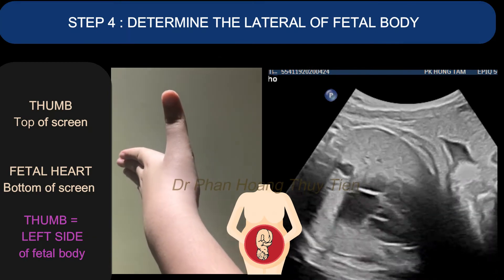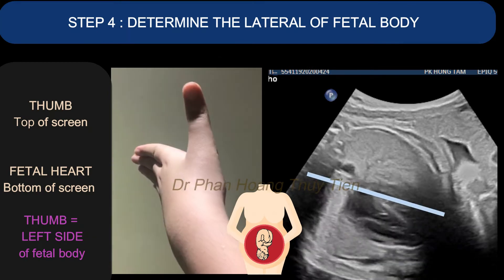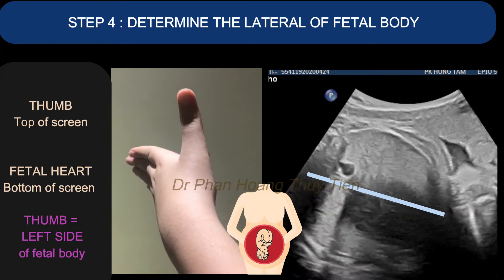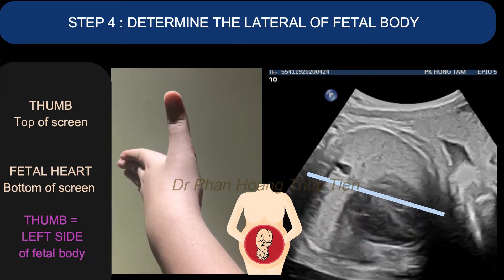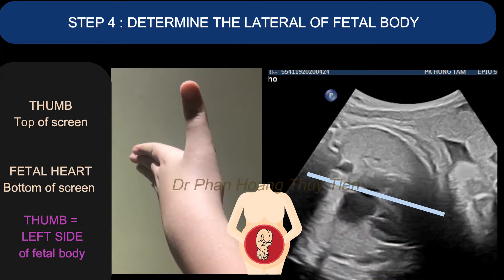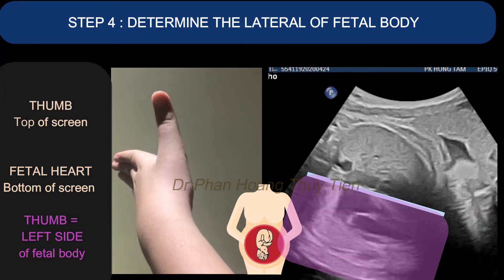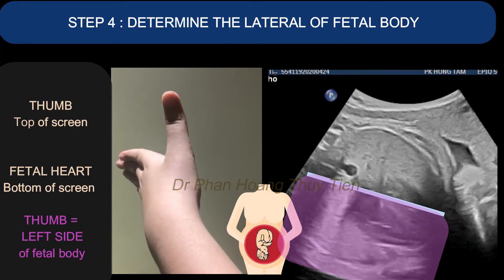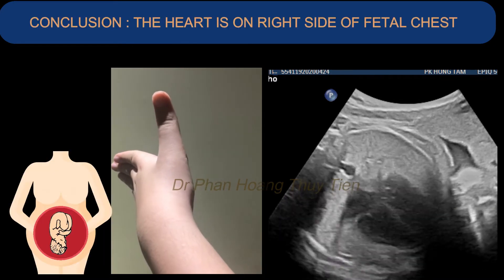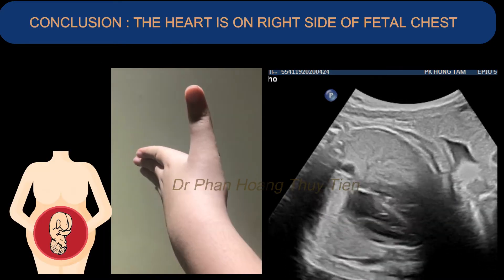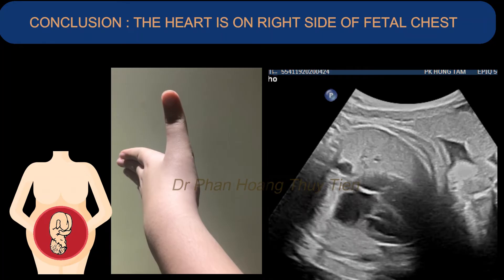Step 4. With the transverse view, you need to create a straight line from the spine that divides the fetal body into half, then apply the technique. You will notice the thumb and heart are positioned as listed below, which leads us to the conclusion that the fetal heart is on the right side of the fetal chest.